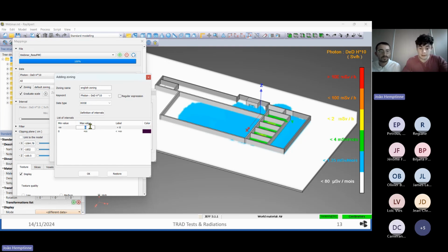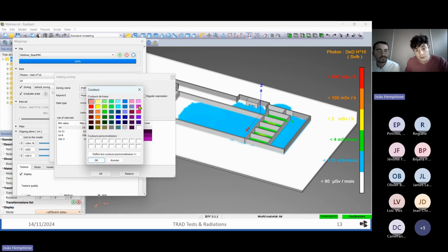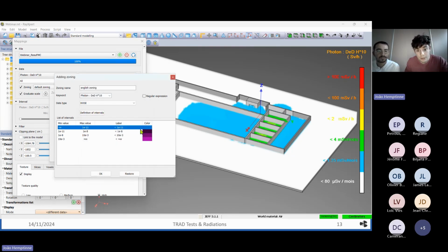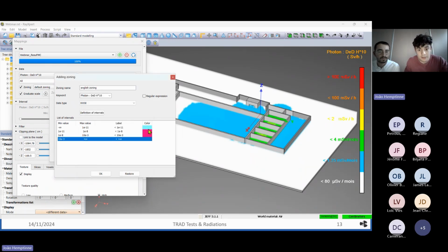For example, here I can set, it's an example, it's not really the English zoning, but it's just in order to give you an idea. Here we put 100. So I just set the different dose intervals. And here you can use the color that you want. For the lower dose, we are going to make blue. Here we can make, for example, pink. Here maybe red, and for the final, black. So you set your own zoning with your own zones.